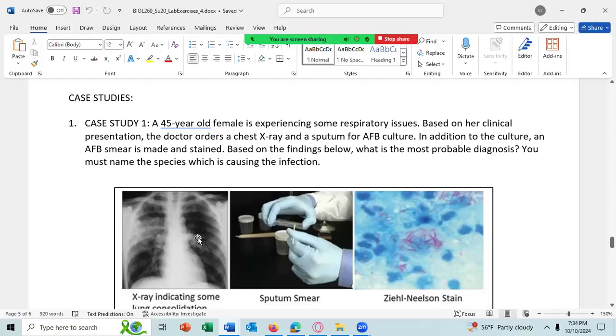And if you don't know, this chest x-ray looks odd. It should be totally black, sort of like this region here, kind of like this region here. And this region there is very white. This region here, this region here, this region here, and that region there. And so something's wrong with the lungs, I'll tell you that.